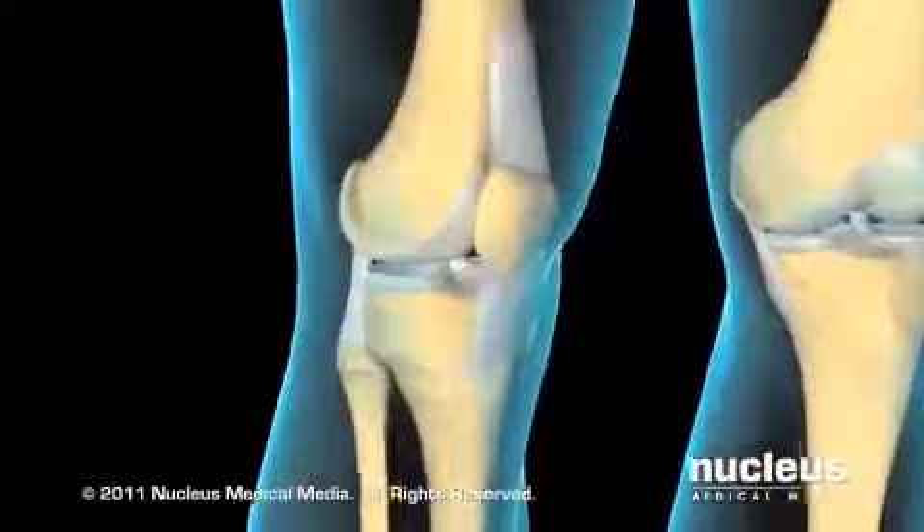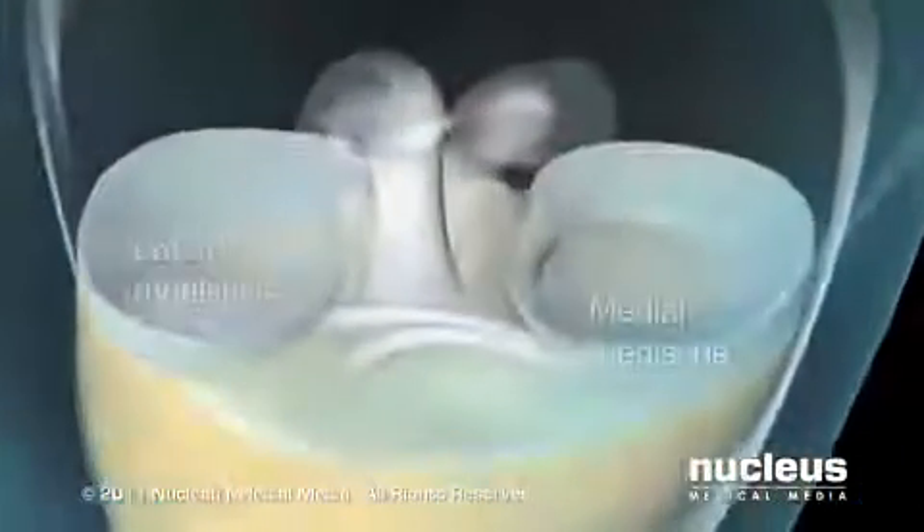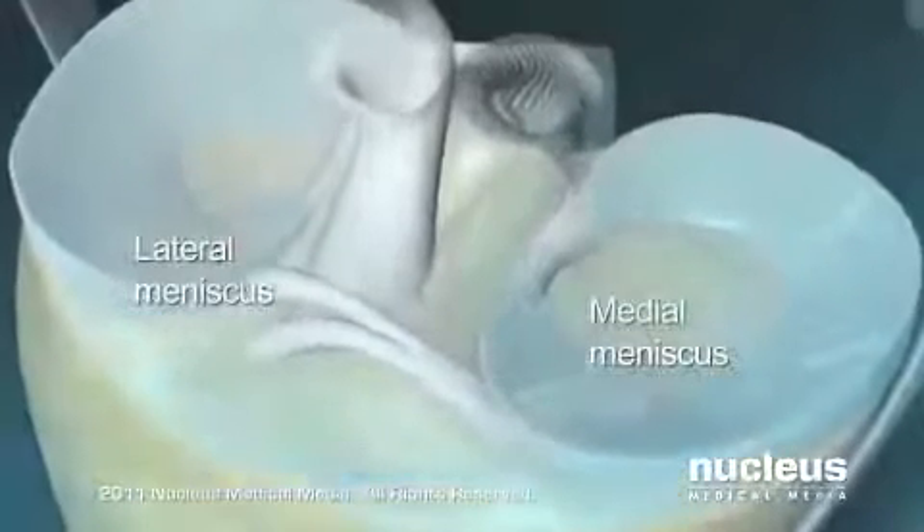Knee arthroscopy is used in the diagnosis and treatment of a number of knee disorders and injuries. One common use is in the treatment of meniscal tears.